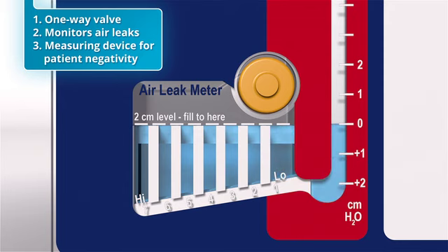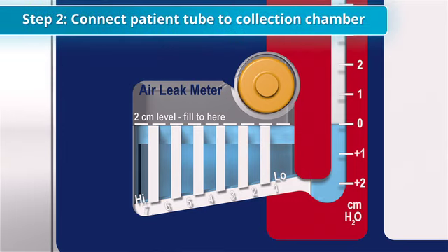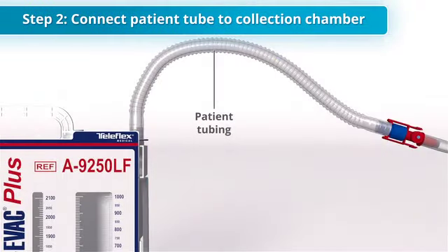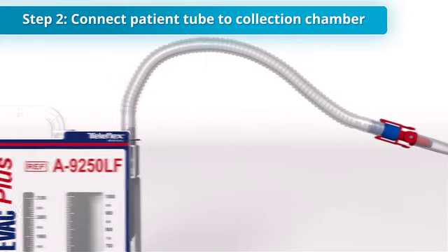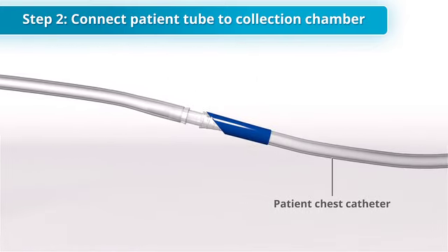Now that the water seal has been established, it is safe to connect the patient to the device. The second step in device setup is to connect the 6-foot patient tubing to the patient's chest catheter. Once connected, the patient is now protected from atmospheric air re-entry.